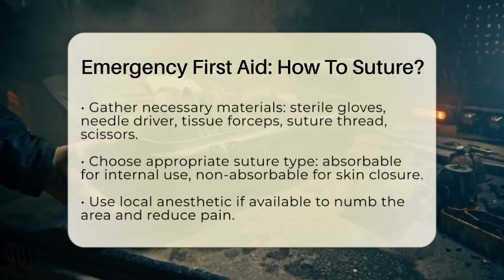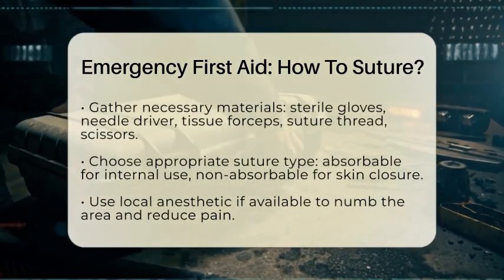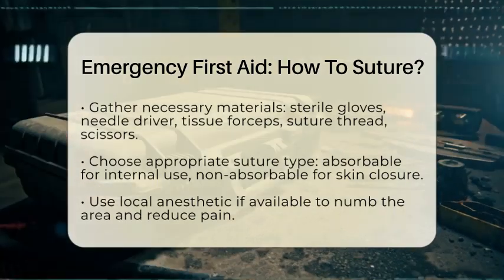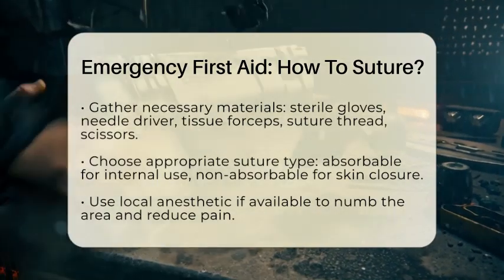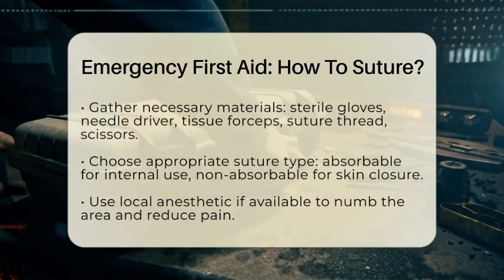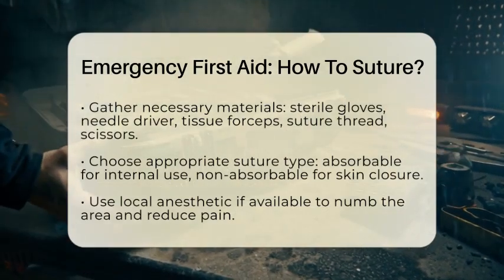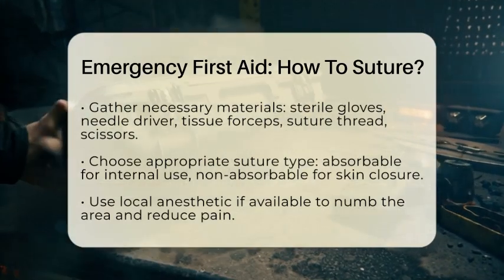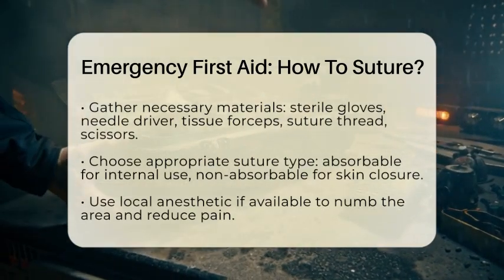Choose the right suture material. Absorbable sutures are used inside the body because they dissolve over time. Non-absorbable sutures are better for closing the skin since they stay in place longer. If you have access to local anesthetic like lidocaine, use it to numb the area. This makes the process less painful and helps you work more precisely.